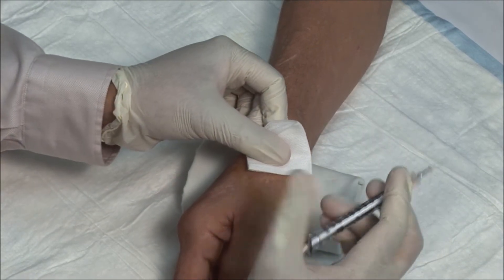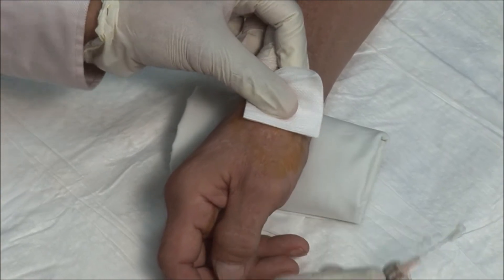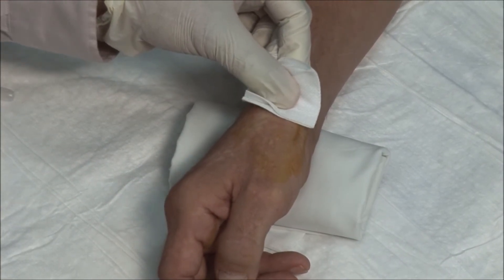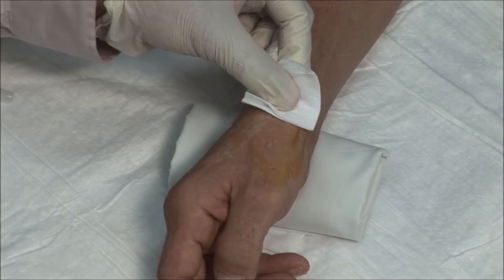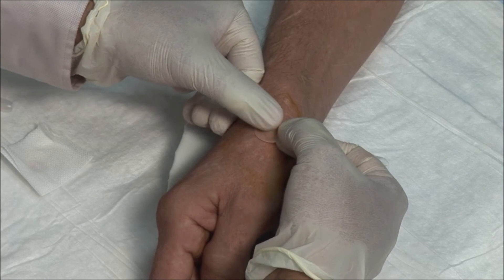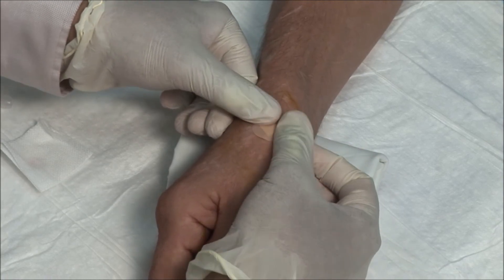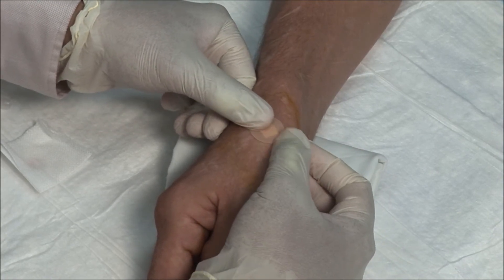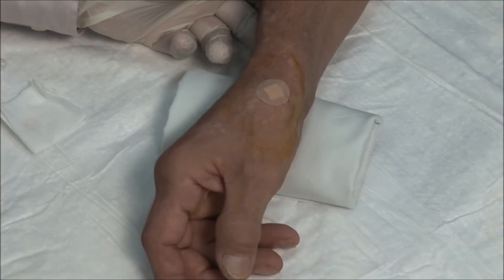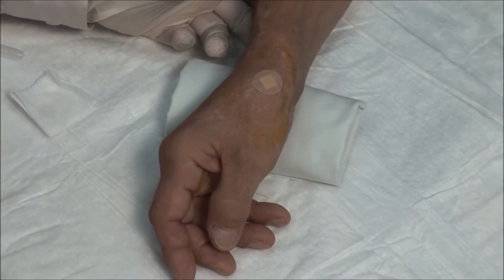Remove the needle, apply the safety mechanism, and dry the area. A band-aid is then applied. Ask the patient to flex and extend the thumb. Pain relief can be almost immediate.